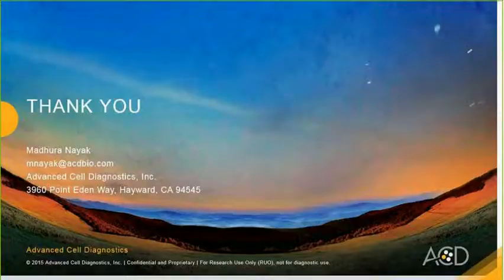What other mounting mediums are suitable for the RNAscope 2.5 HD duplex assay? We have currently validated our assay with Vectamount and found that it preserves the signal intensity of the chromogens well. We have not yet validated with any other mounting mediums and therefore recommend strictly using Vectamount mounting medium for this assay.